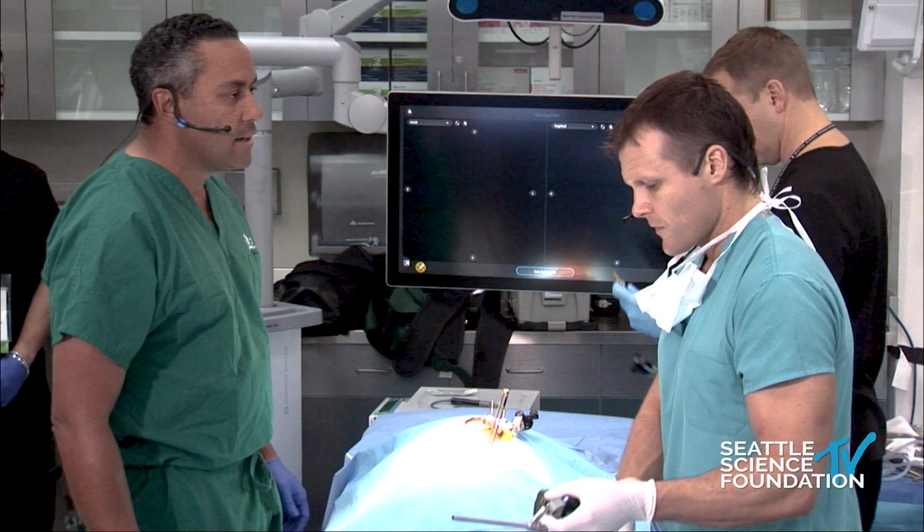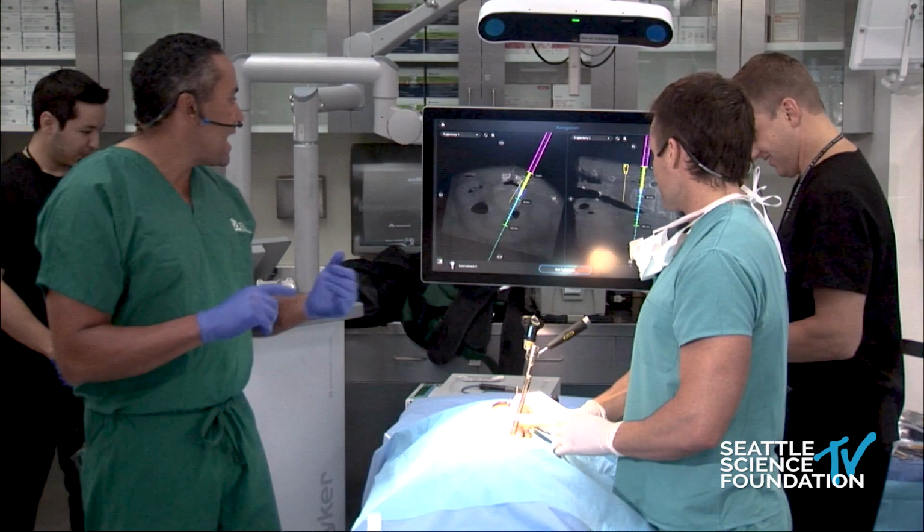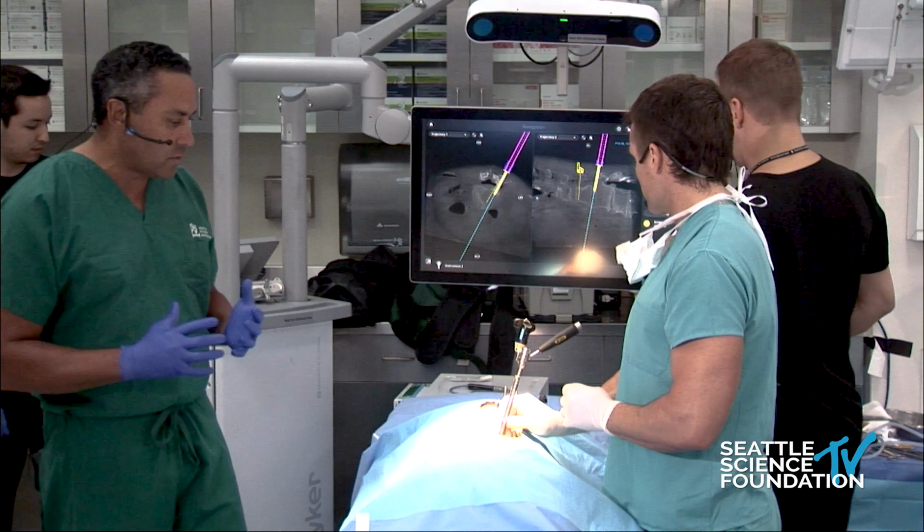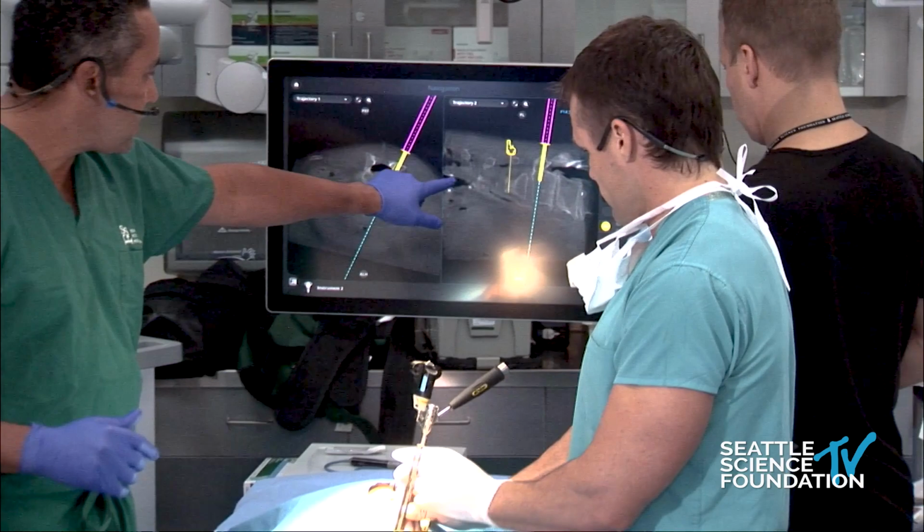Yeah, so I hate radiation. I hate K-wires. I hate extra steps. I hate anything that is costing time. So there you go. So you're at the skin. You've got a tip extension that tells you that's where our incision should be.